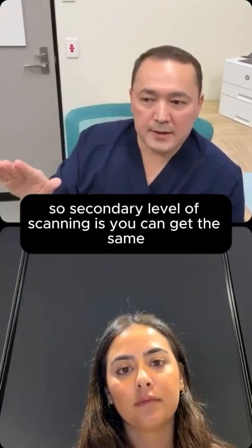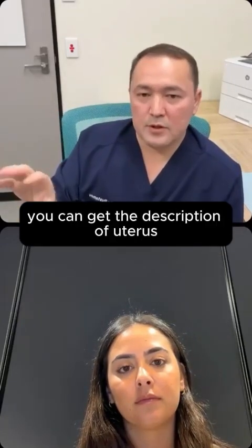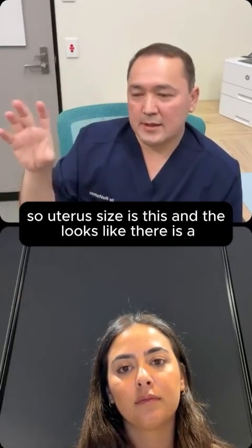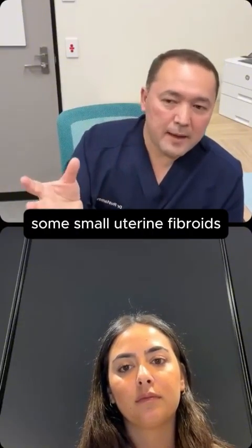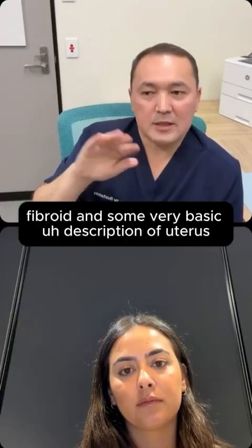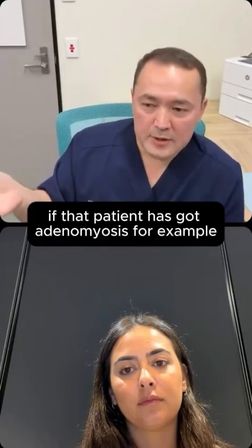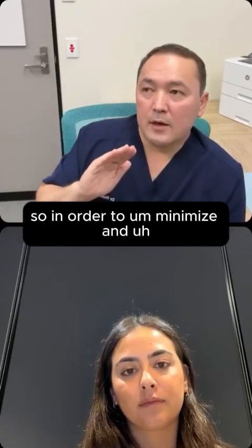A secondary level of scanning gives, for the same patient, a description with the exact size of the uterus and a little more detail. So the uterus's size is this, and it looks like there is some small uterine fibroid, with some very basic description. Then for the same uterus, if that patient has adenomyosis, for example, you may have a very thorough description of the uterus.